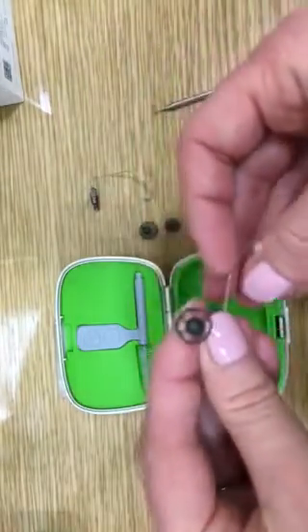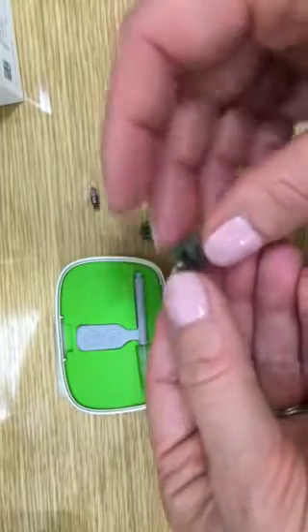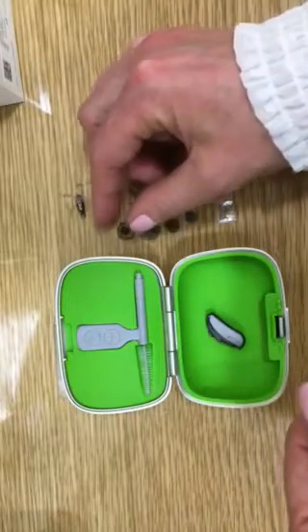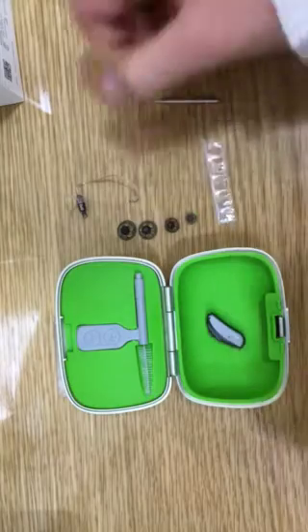Make sure you select the same dome as the one that was on your old receiver. In this instance we have a large dome, therefore we will be putting the fresh large dome on.